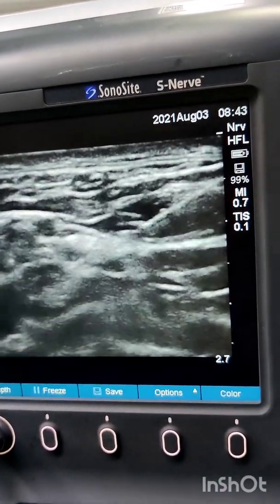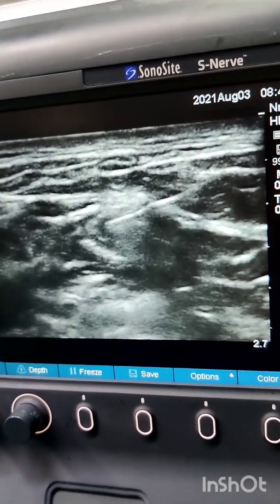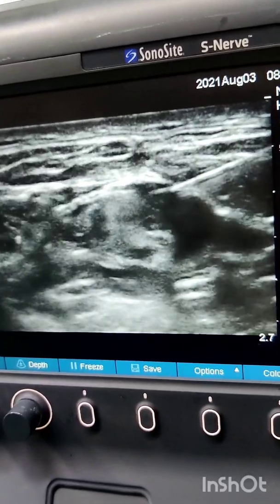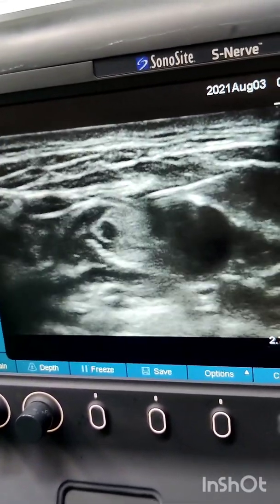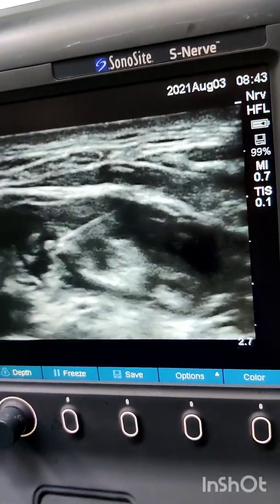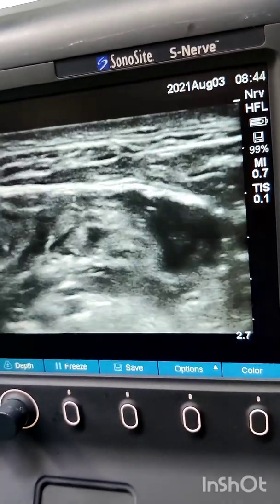Once the needle tip has punctured the fascia, inject about 2 ml of the local anesthetic drug and check for its spread. This is the first injection, which is superolateral to the plexus. Once you are happy with the spread of the drug, inject around 10 ml of local anesthetic drug over here. Inject in small aliquots of 2 ml each.